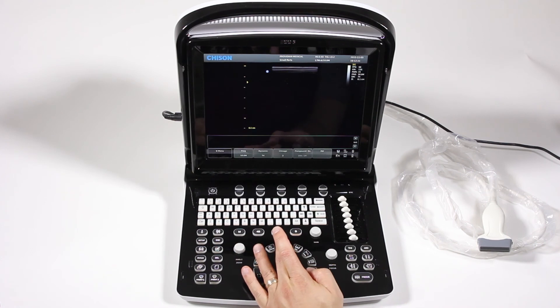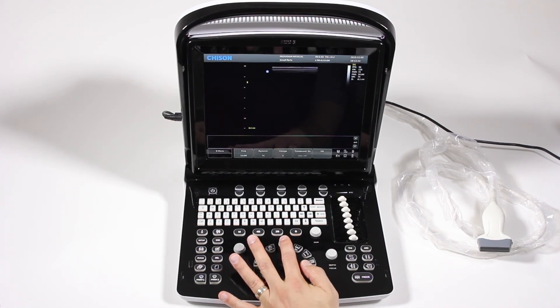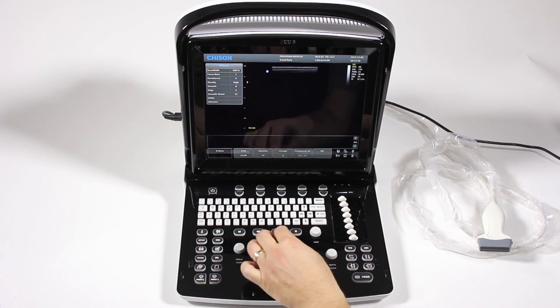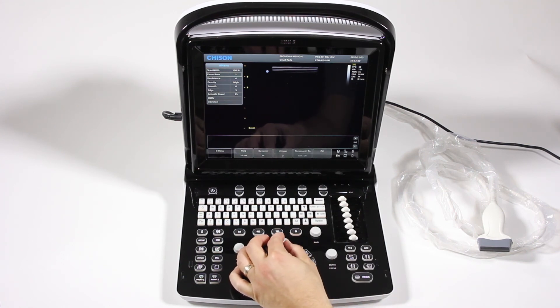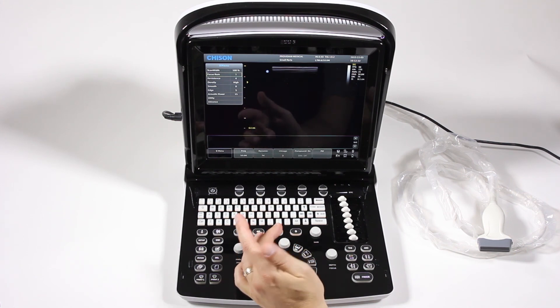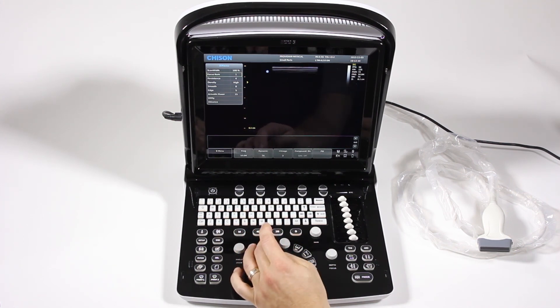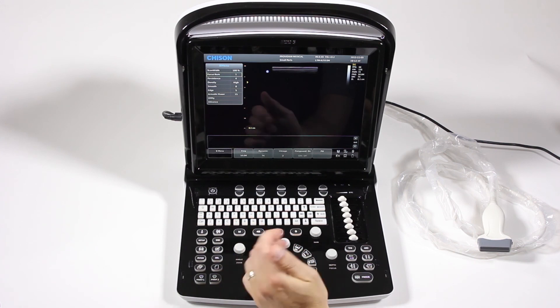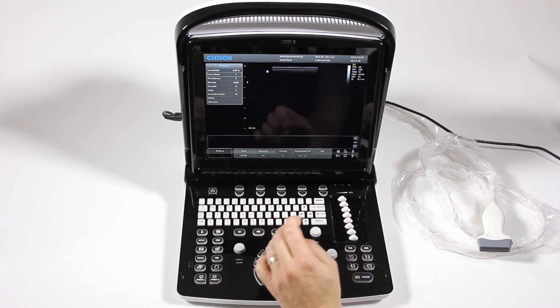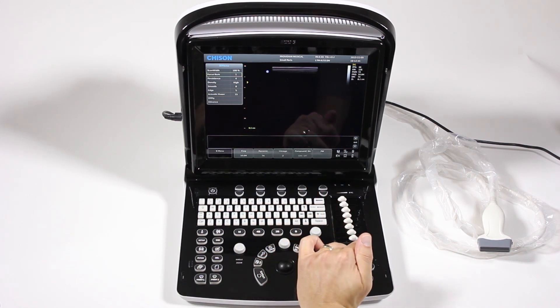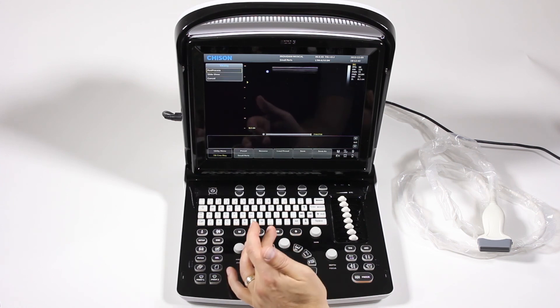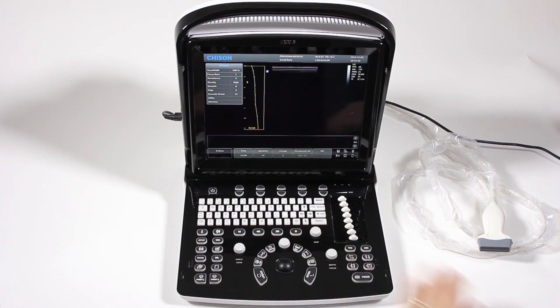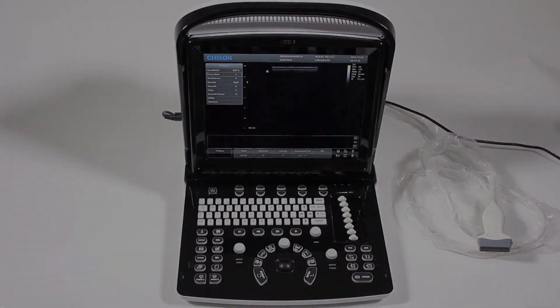Finally, we have a little menu key here. It's not labeled, but when you push it down, a sub menu comes up where you can twist, and then you push down and make an adjustment to that parameter. Now, this sub menu will change depending on what imaging mode you're in. If you go into Doppler or something of that sort, it's going to have a completely different menu, and it also changes whether you're in a frozen image or not. Next, we'll get into imaging with the Chison Eco 3.